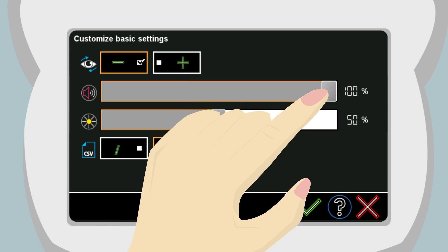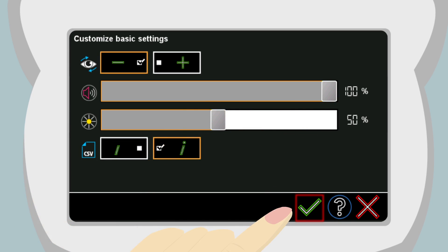Notice that when Anna changes the volume, a green checkmark appears in the navigation bar. Touching the green checkmark saves any changes she has made.